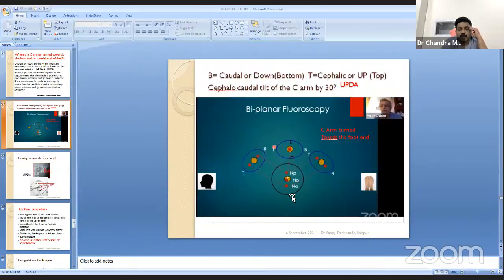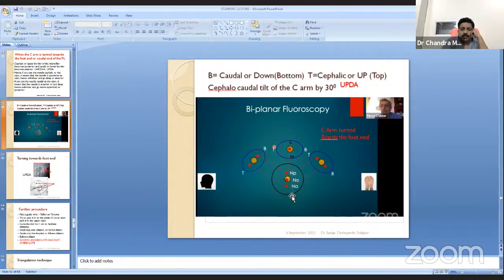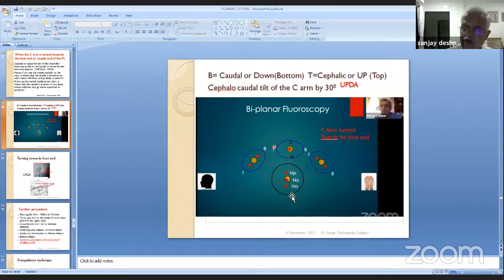I had a Siemens Siremobile C-arm, which is very good. We had a Siemens which was giving the exact same time lag in the past. That machine is not produced now. So now what they have ordered is this Kiran from Chennai. Chennai-based.